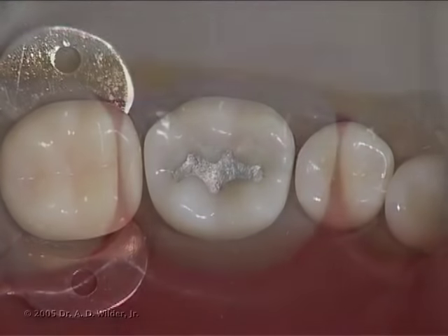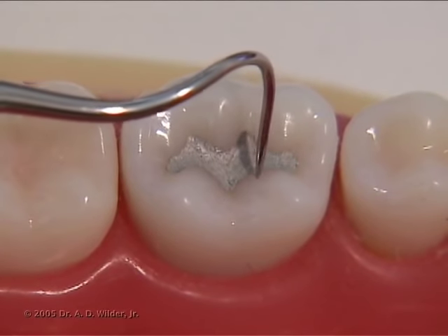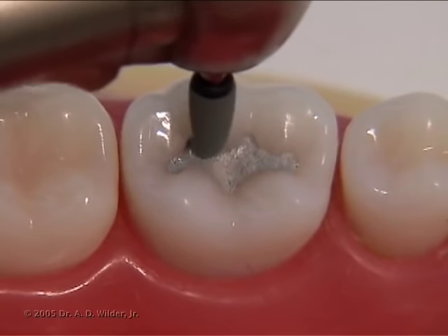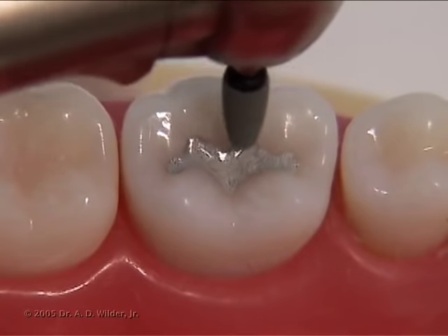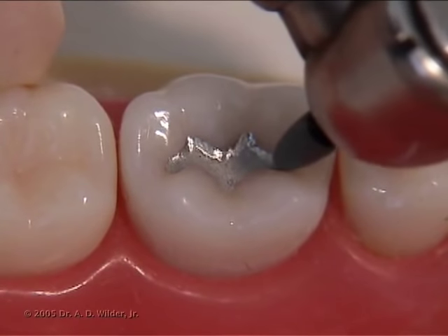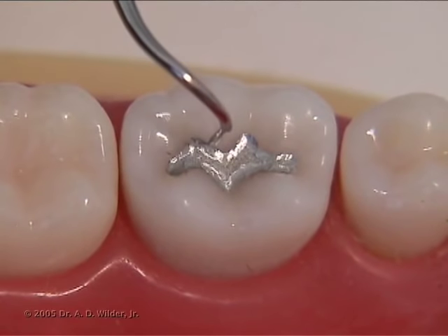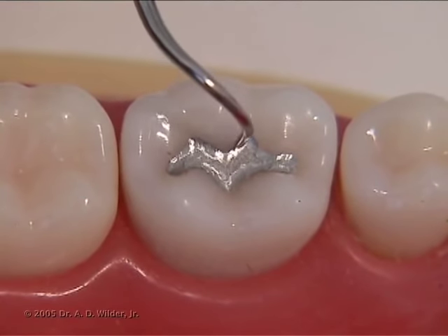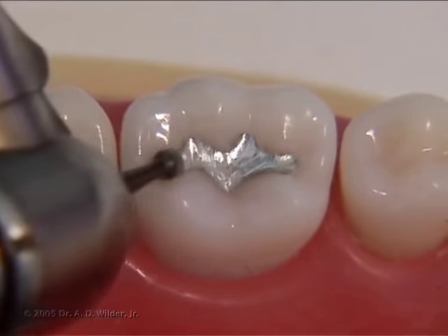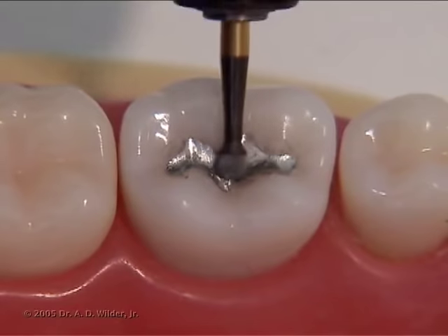Amalgam develops its final strength at around 24 hours, so ideally you want to wait this long to polish. You can confirm that the amalgam is fully hardened with the tip of an explorer. An abrasive greenstone or round bur is used to polish the surface. A rounded end is preferred to avoid gouging and scratching the material. Polishing the amalgam will help to create a smooth CAVO surface margin, resist corrosion, and reduce plaque retention.